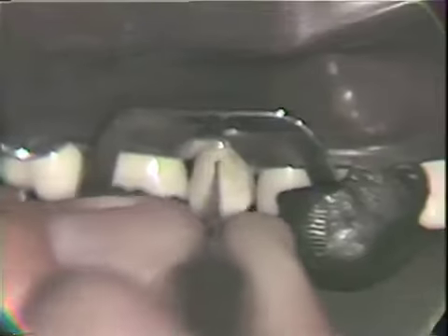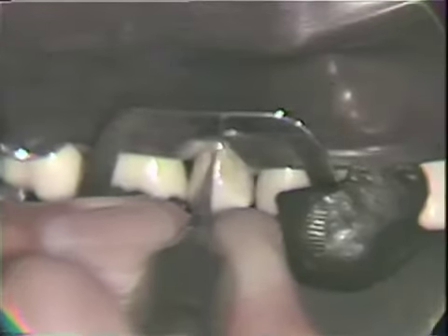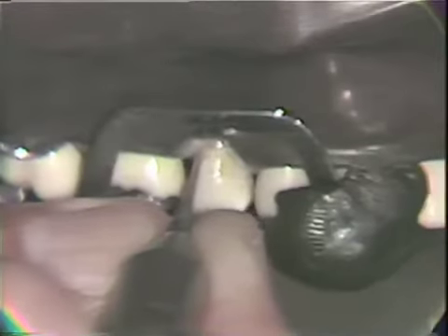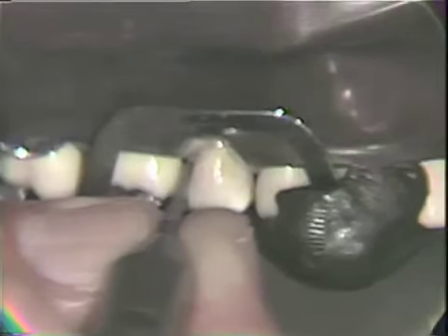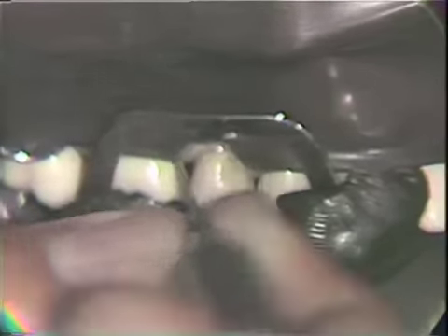And we're winding up now in the central area with a little bulge in that axial wall that's not necessary. Indeed, that bulge should be removed. And we'll be establishing an axial wall that has a general contour of the outer surface of the tooth.